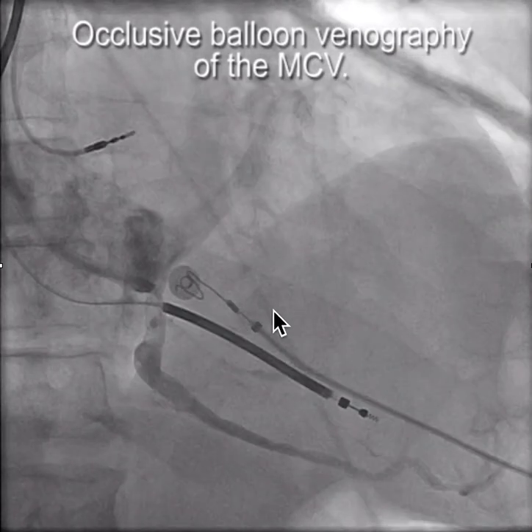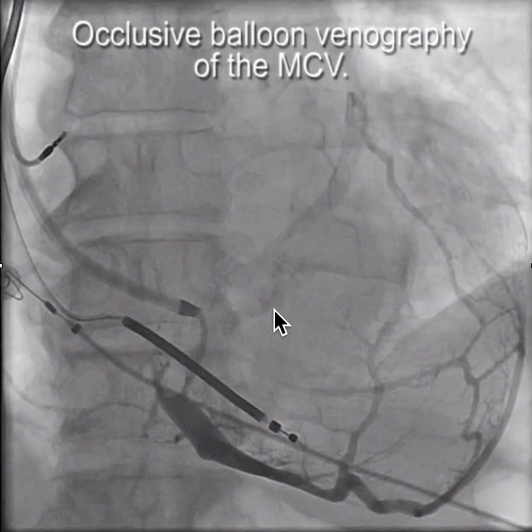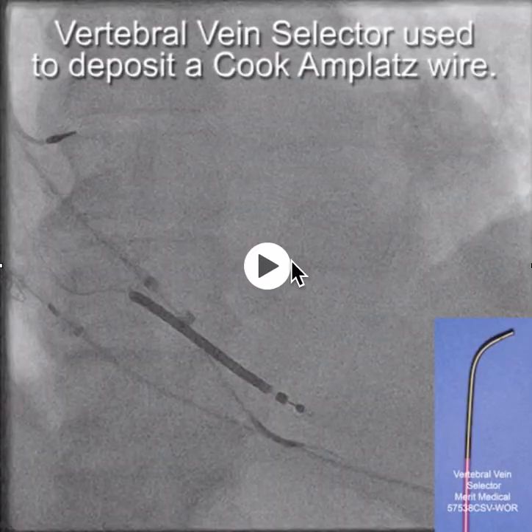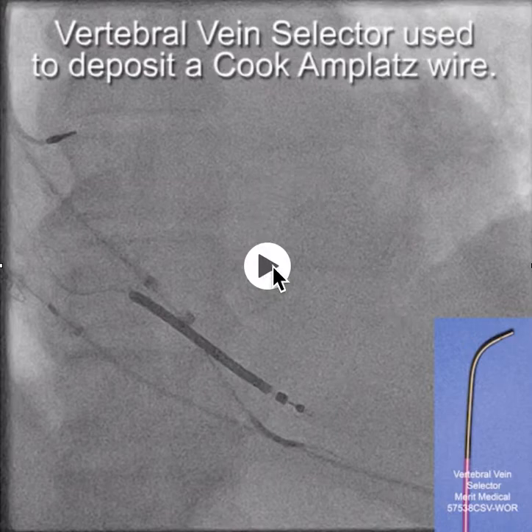So we're looking at it in multiple views to try to figure out how we're going to get in there, and whether we should actually try to implant down here somewhere and try to get into the lateral wall this way, or to go back up into the coronary sinus. So ultimately, we decided to go up into the true coronary sinus.